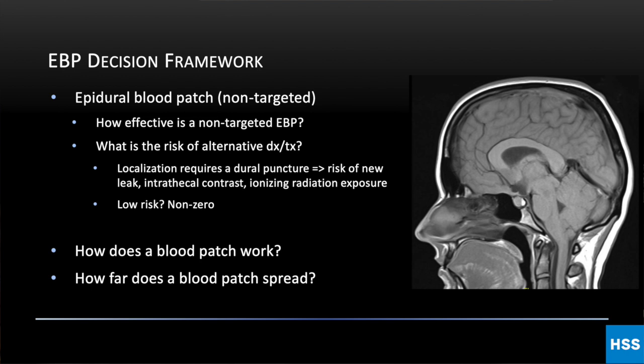Intrathecal contrast is very well tolerated but has a non-zero risk profile. And I think most importantly, there can be significant ionizing radiation exposure from these studies. Some other questions that come to mind: how does the blood patch work and how far does this patch spread?